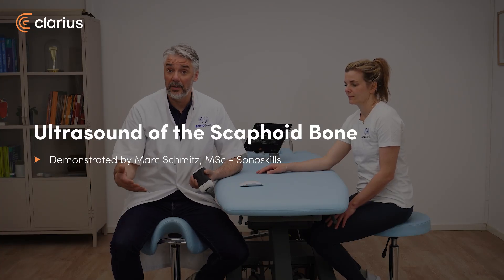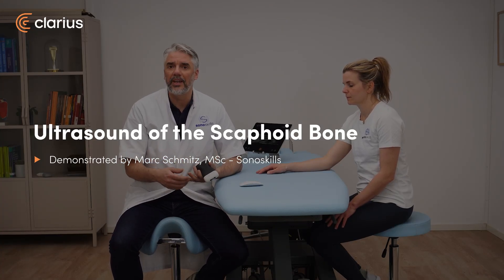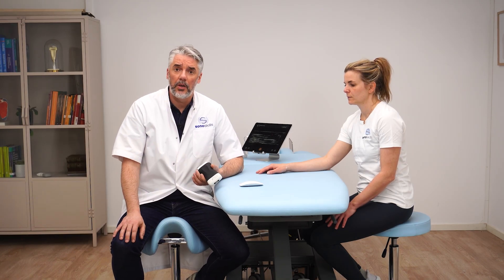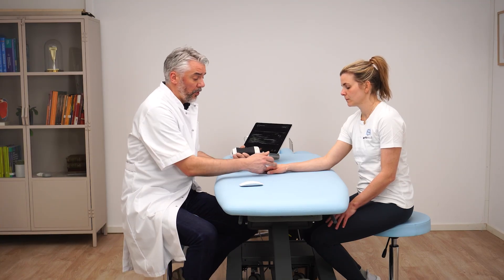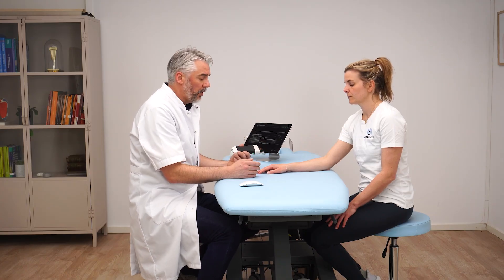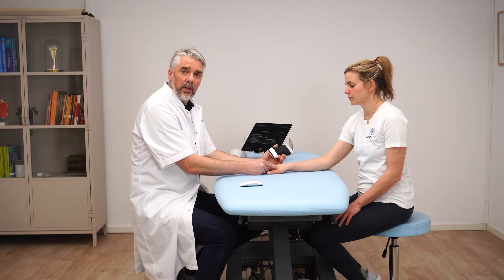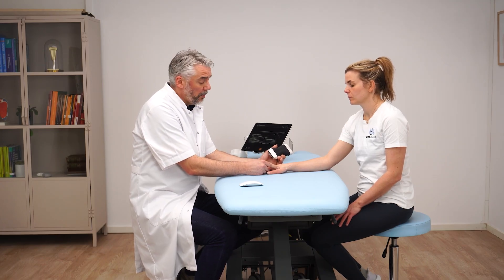To scan the scaphoid bone, you can use ultrasound to detect fractures which can be missed with X-ray imaging. We can have a dorsal approach or a palmar approach — I'm going to show you both. For both approaches it is really important that the patient makes an ulnar deviation, because only then you can see the full scaphoid bone.